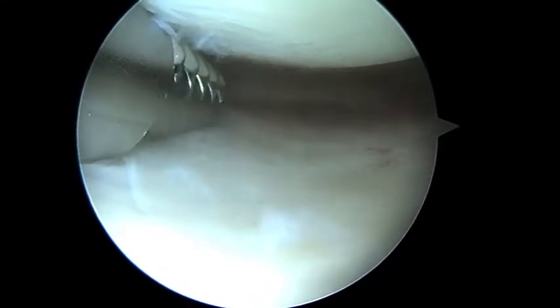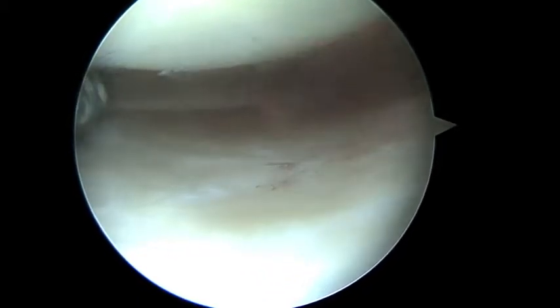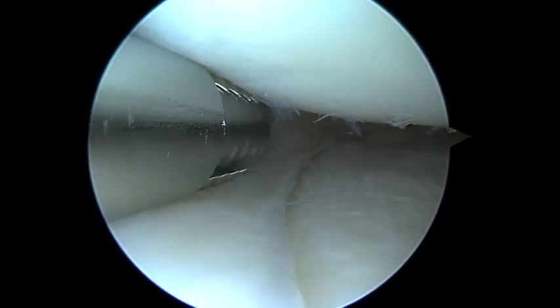Now we're looking at the posterior horn of the medial meniscus. I'm pushing all the way to the insertion there. That looks good. So we're going to look in the intercondylar notch next.